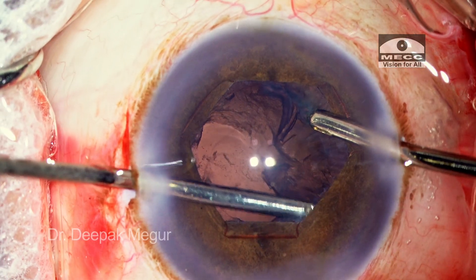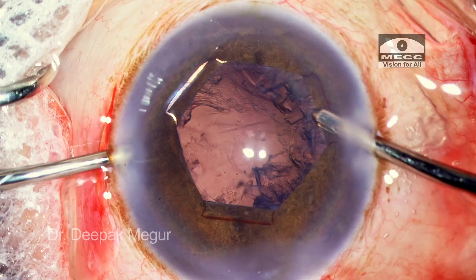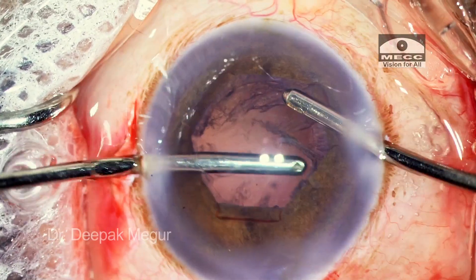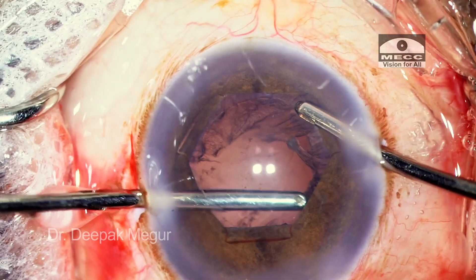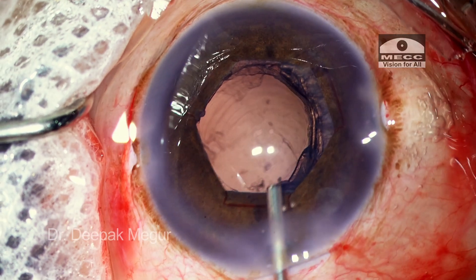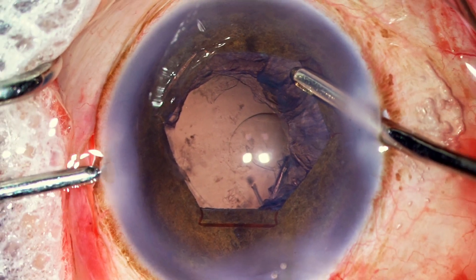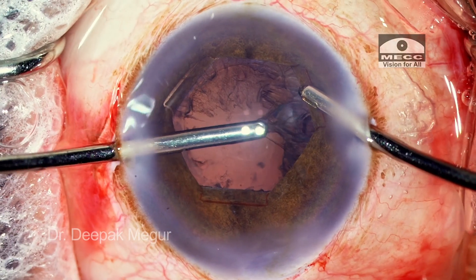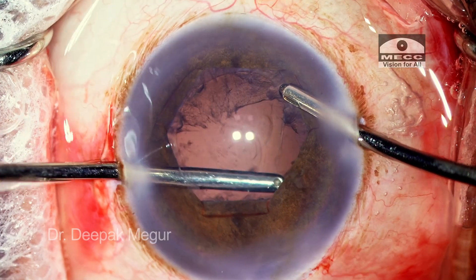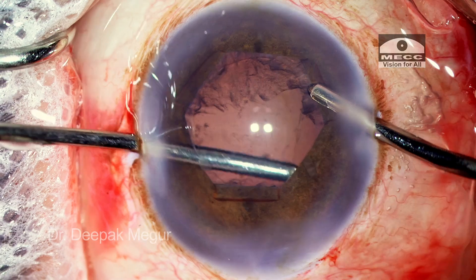The patient says he's comfortable now, breathing all right, and everything seems to be good, so she begins the surgery again. But this time the pressure is relentless. As she's about to begin cortex aspiration, the patient has a severe bout of relentless coughing. There is one important visual cue which is present: tiny particles floating in the Berger's space, much posteriorly below the posterior capsule — that should raise some concern. The reason for the positive pressure is obvious: there is fluid misdirection happening because of the lax zonules, and fluid is traversing across the zonules into the Berger's space, causing immense positive pressure. But this has not caught her attention and she's going to go in with the bimanual I&A.